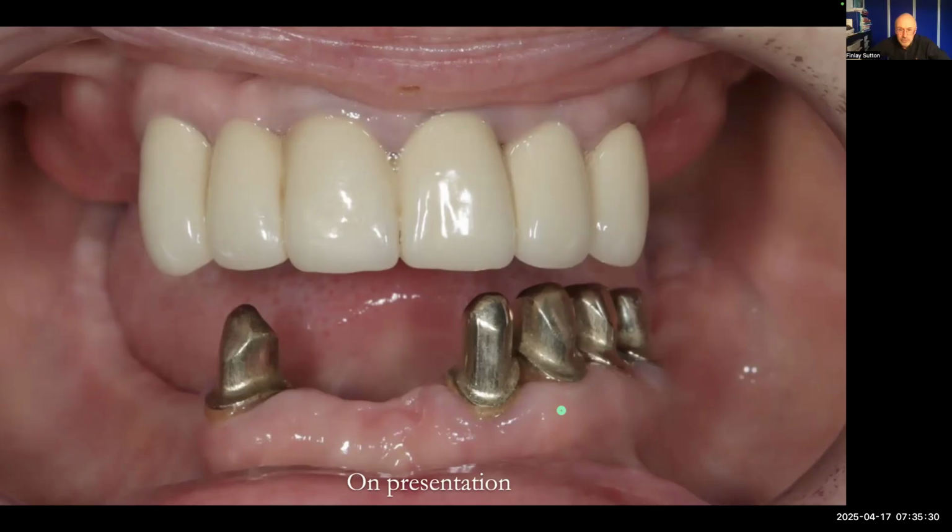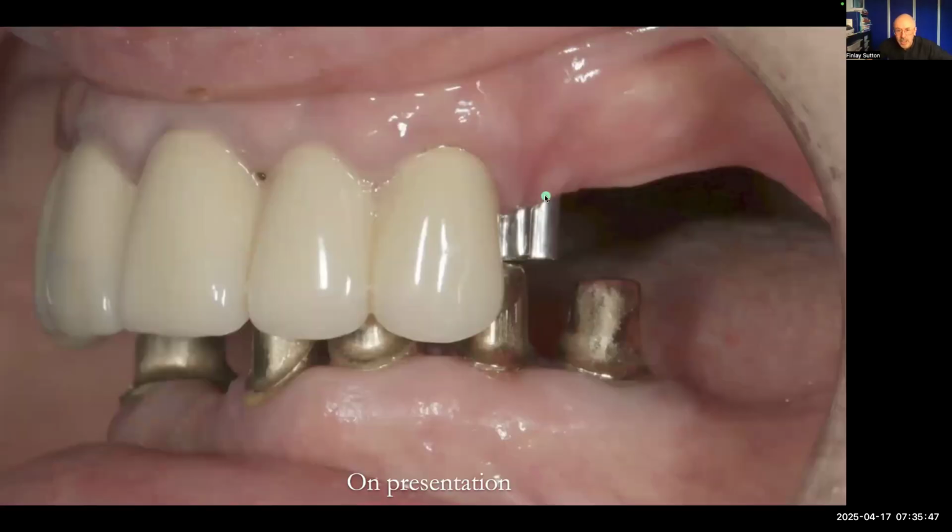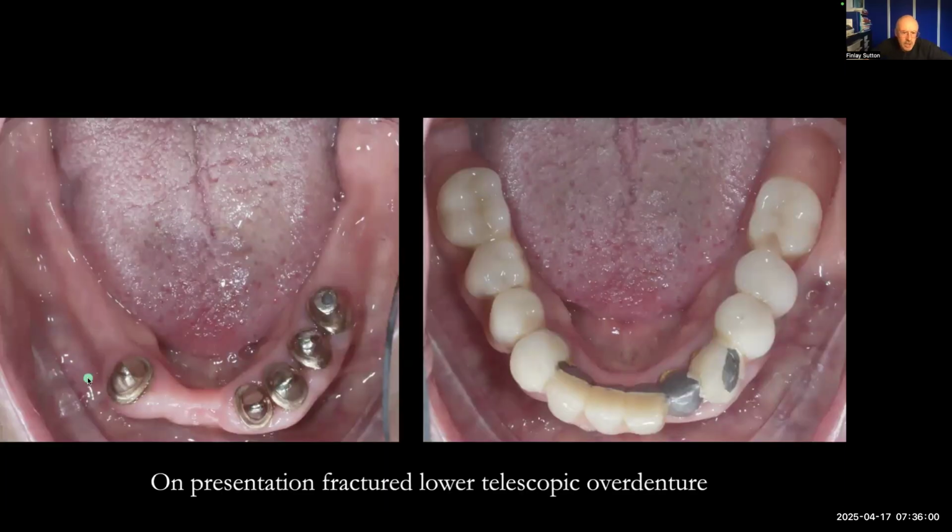So she's got reasonable oral hygiene. Let's have a look at the top there. We've got these linked crowns. So this is a bridge at the top here, 3, 2, 1. That's a linked bridge, and then we've got separate crowns, 1, 2, 3 there, and then off the back of these are little rods where a slot attachment can fit. And then this is the lower arch here.